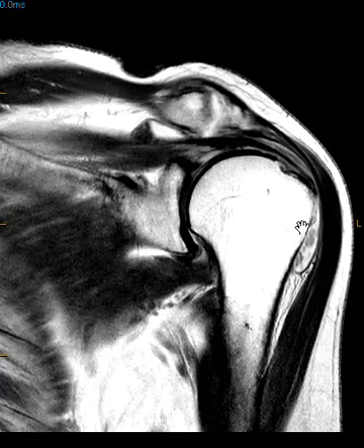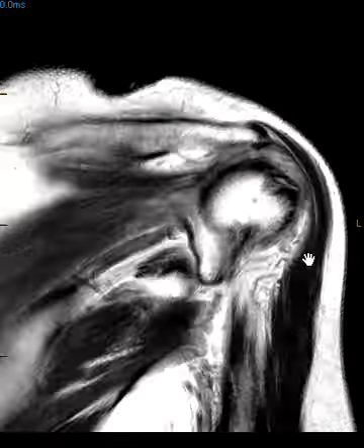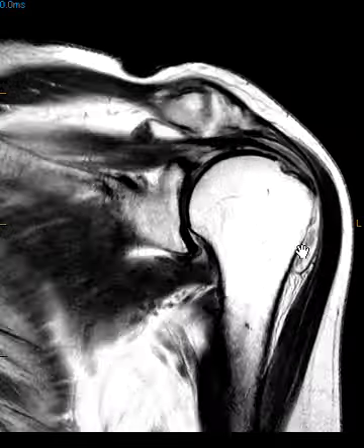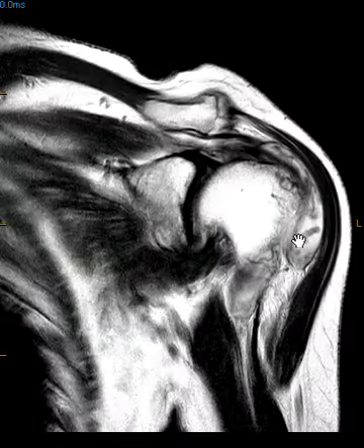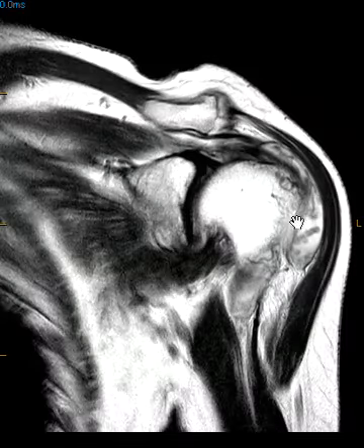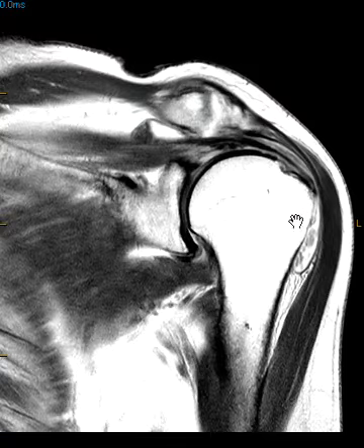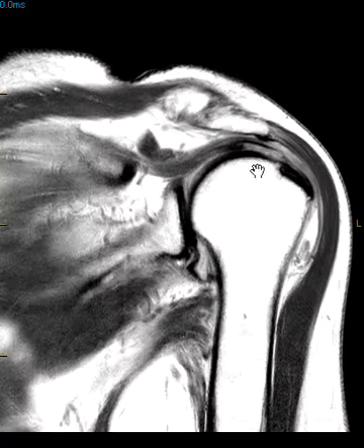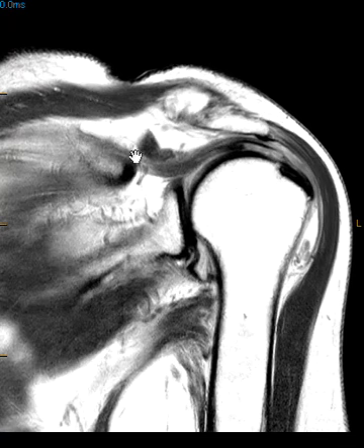You can see the outline of the bursa here. This does push down on the supraspinatus tendon, so the main finding is a big bursal effusion with rice bodies. The patient also had a partial thickness — probably a high-grade partial thickness — tear of the supraspinatus.